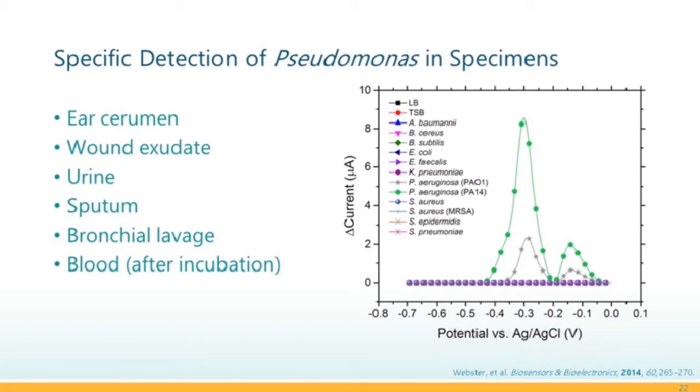And so this was an important part of the IP puzzle for QSM diagnostics, is that there's an electrochemical potential window in which you can measure biological samples such as urine, sputum, blood, ear exudates, and detect these molecules without any interference. And so we were able to test out that we can see these QSMs in this window with zero sample preparation. So directly placing these samples onto a sensor surface and doing the measurement.